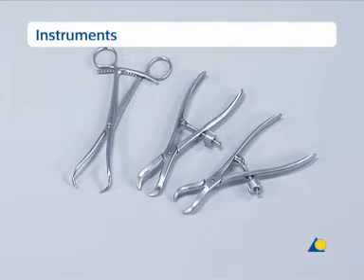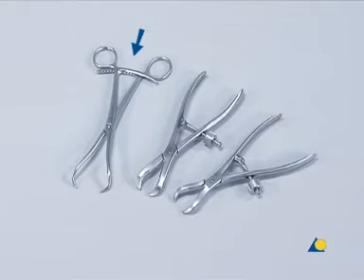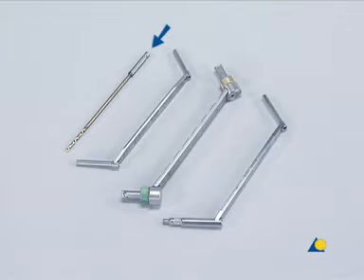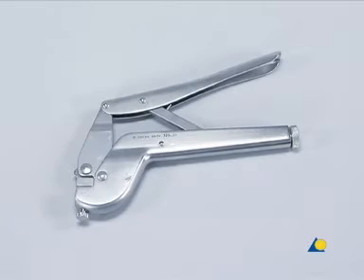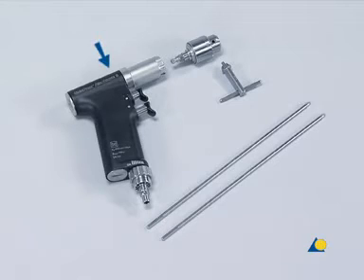The instruments needed are, from left to right: the large pointed reduction forceps, two large-toothed reduction forceps, the gold 2.5 mm drill bit, the 3.5/2.5 double drill guide, the 3.5 LC-DCP drill guide or the 3.5 universal drill guide, the gold 3.5 mm tap with T-handle, the depth gauge, the screwdriver with holding sleeve, and the bending pliers. Also needed are the compact air drive or a similar device, the chuck and key, and two 4.5 mm diameter Steinmann pins used for the intramedullary pinning.